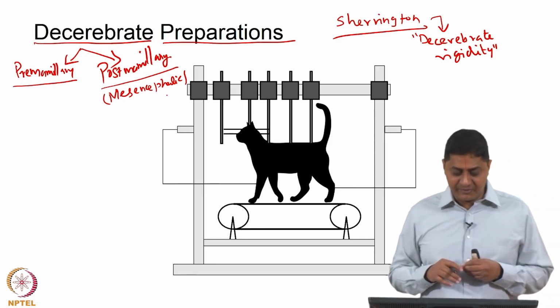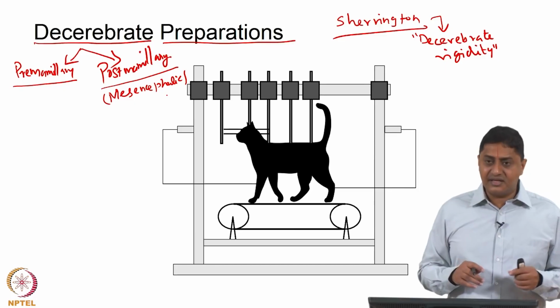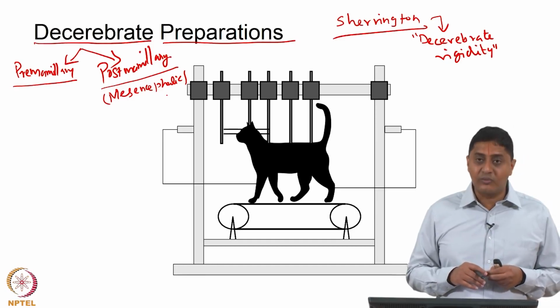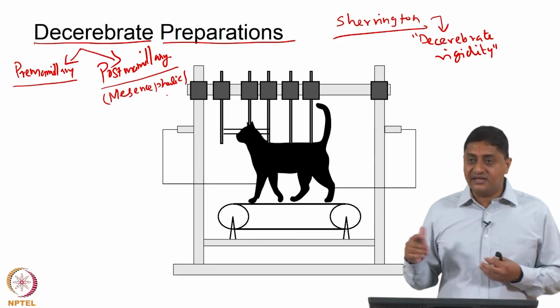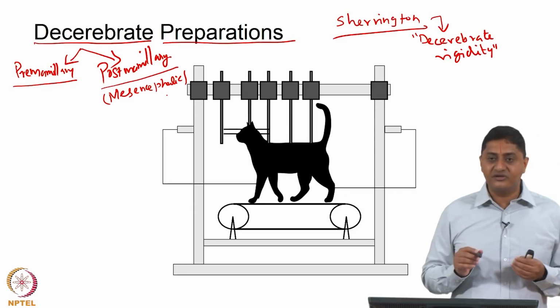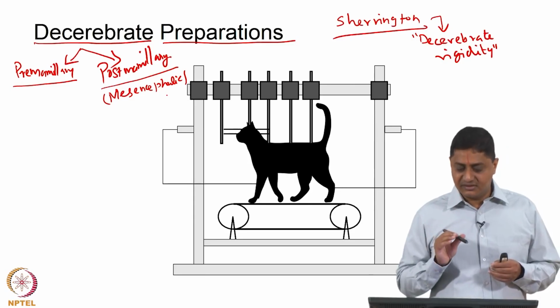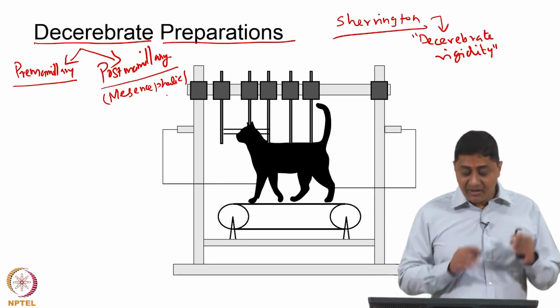If it is the pre-mammillary case, there is going to be spontaneous locomotor activity, but in the other case you need to have electrical activation of the midbrain locomotor region. So, if I appropriately stimulate the midbrain locomotor regions, I am going to see locomotor-like activities.